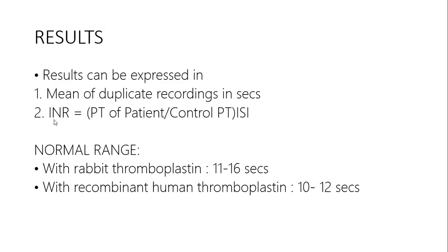And we can also express the PT in INR. Again, we calculate the INR by dividing the PT of the patient by the PT of the control sample, raised to the ISI, or the International Sensitivity Index, that is provided by the manufacturer.